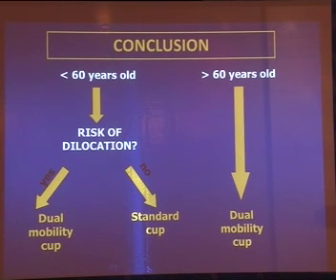To conclude, the SynFit last generation achieves a satisfactory long-term survival rate, taking into account our results in terms of postoperative prosthetic stability and long-term implant survival. We advocate the systematic use of a dual mobility cup in patients over 60 years of age, or younger patients at risk of postoperative instability. Thank you very much. Questions?